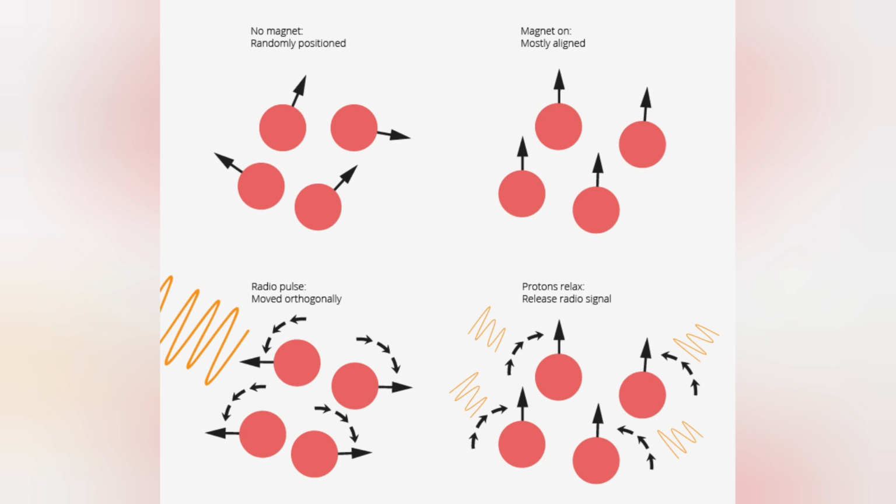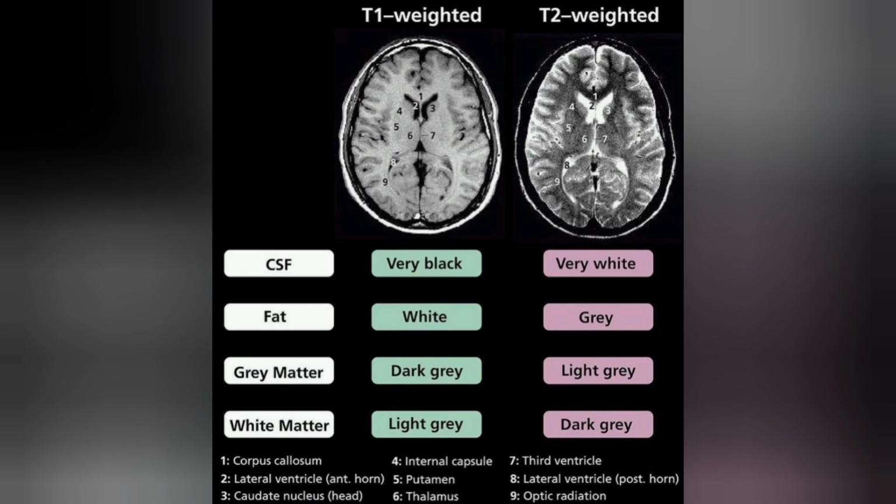image. T1, T2 is an image which is time to dephase 37% of transverse magnetization when the radio frequency is switched off. T1 is time taken for 63% of protons to achieve longitudinal magnetization after the radio frequency pulse.